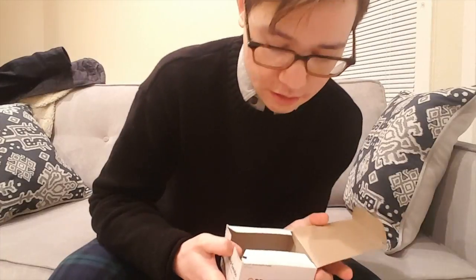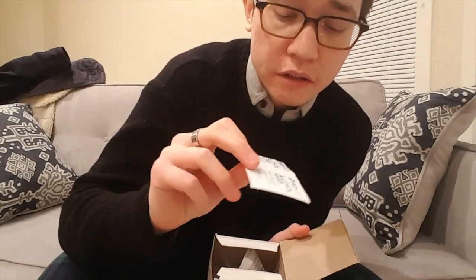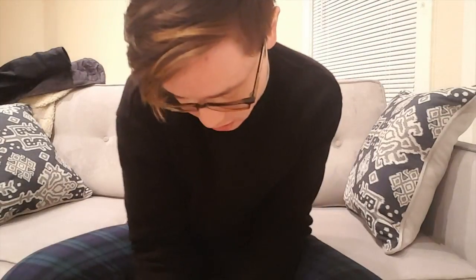and two, when it processes through the body, it's sort of in solution. Armpit is a little oven. Meanwhile, I'm going to get ready with little alcohol swab pads. I use one to clean the top of this little vial before I stick a needle into it, and the other one is going to be used to clean my leg where I'm going to inject.